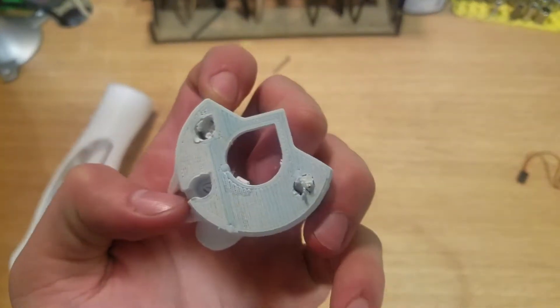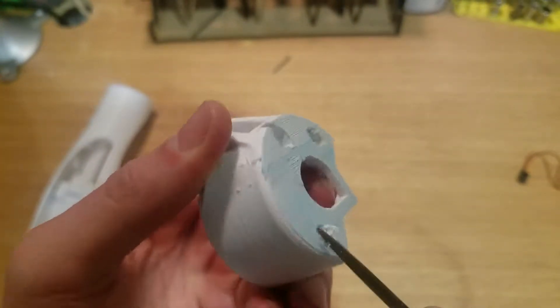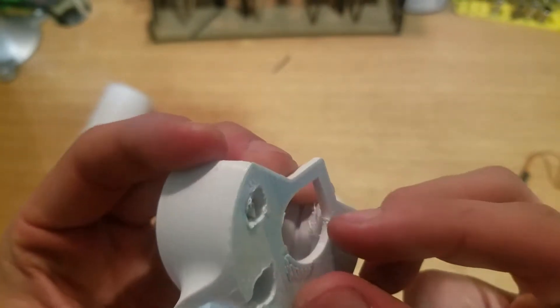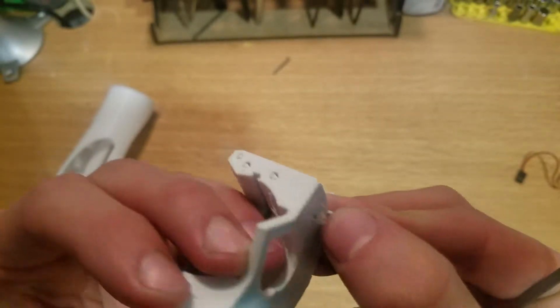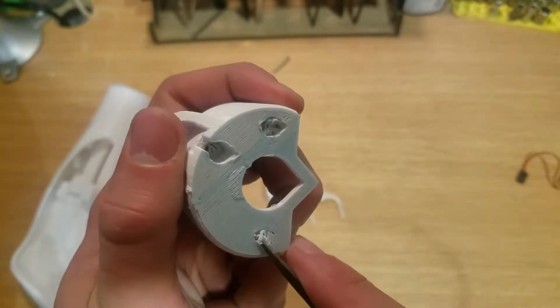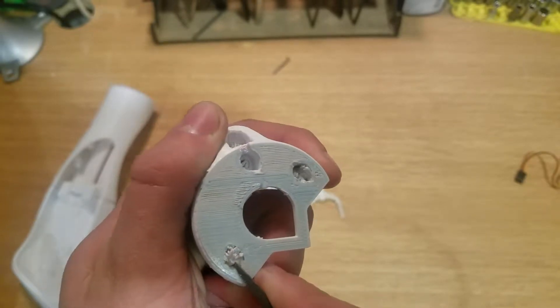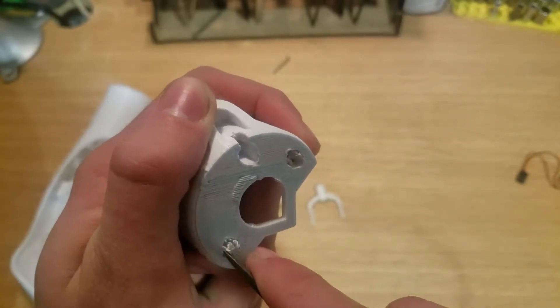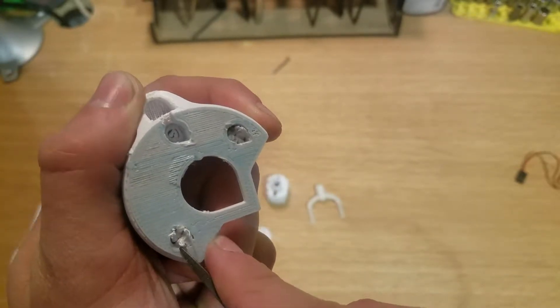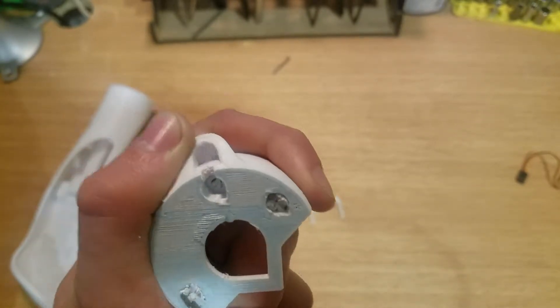This is just some of the support material that the printer uses while printing to be able to make circles and things. You have to get this support material out. One of the ways to do that is to use a dual-head 3D printer so it can do two materials at once — one in plastic and the other in a dissolvable filament. At the end you'd just stick it in water and it would dissolve away.